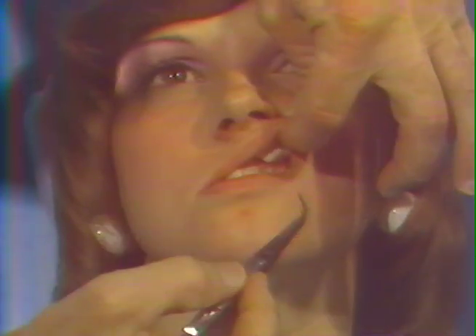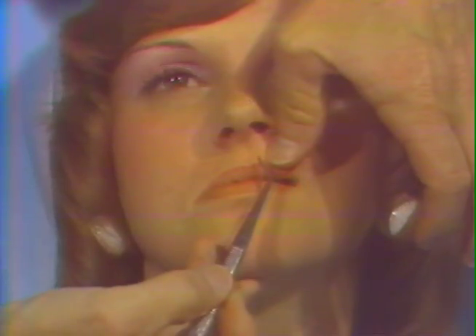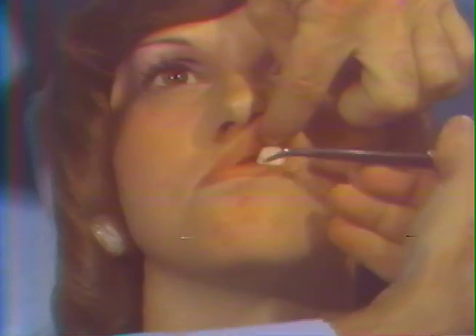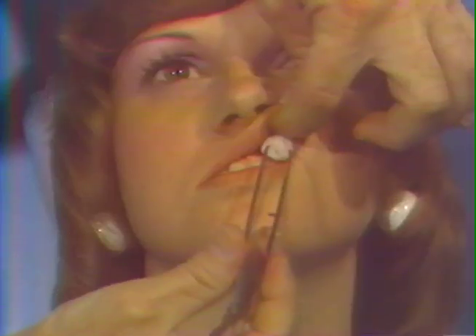If the reverse is desired, place it to the opposite side of the midline so that topical anesthesia will be produced to the left of the midline. The needle can be placed horizontally and passed to this portion of the tissue to produce local analgesia. Now open again.